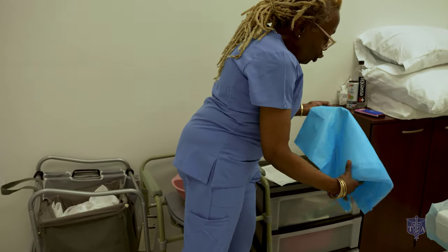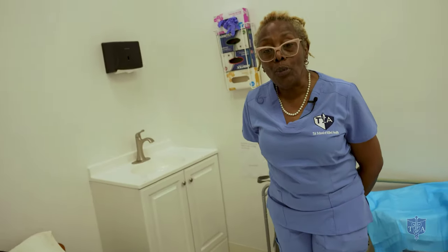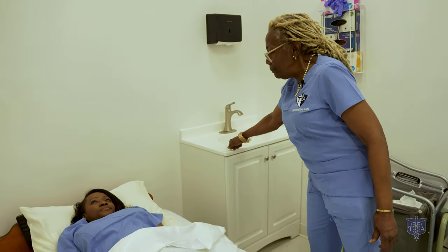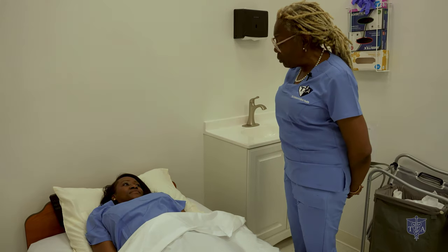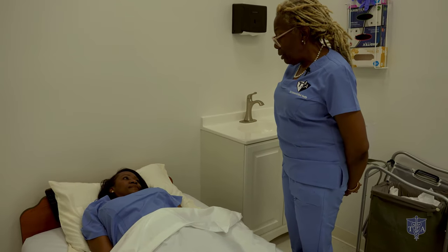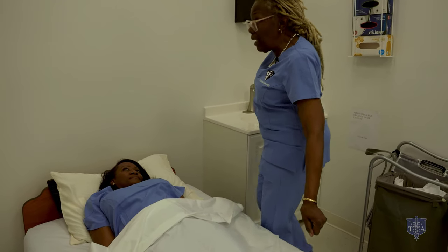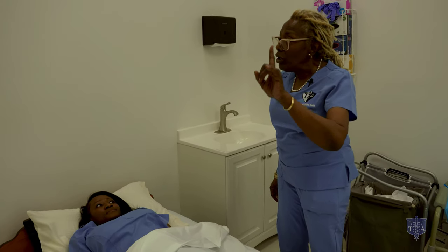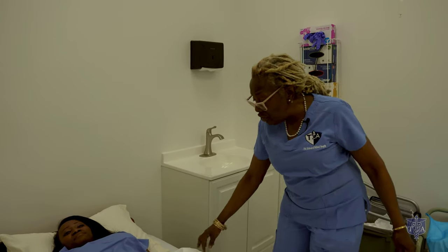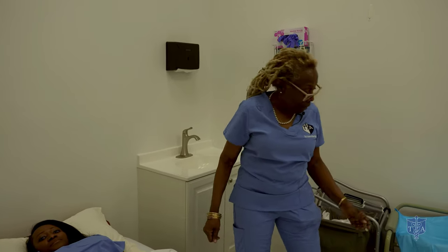I'm now going to knock on the door and introduce myself, and show you how to apply the bedpan appropriately. Good morning, Mrs. Jones. How can I help you this morning? Handwashing is required. I'm going to lock the bed and provide privacy — don't forget for the state boards to please touch the curtain. You don't need to check the ID for someone that needs a bedpan; they need the bedpan, so let's give it to them.